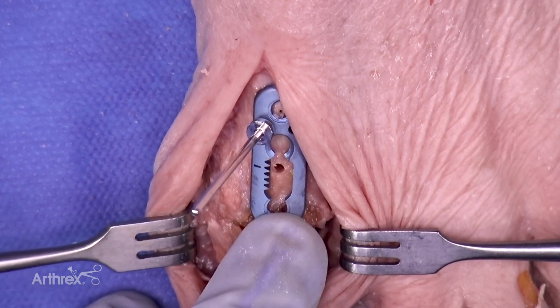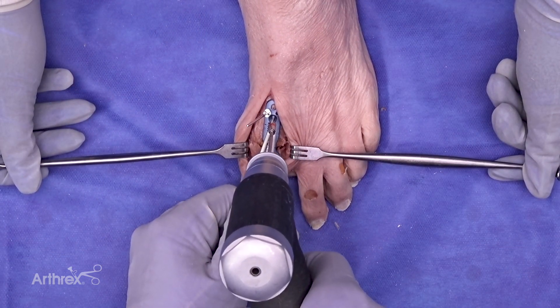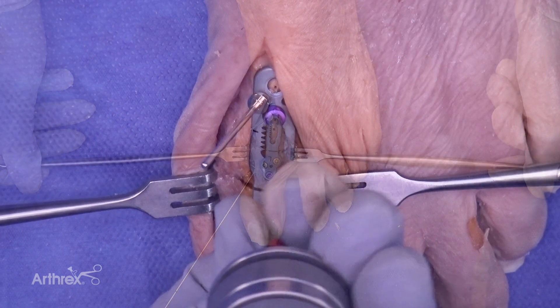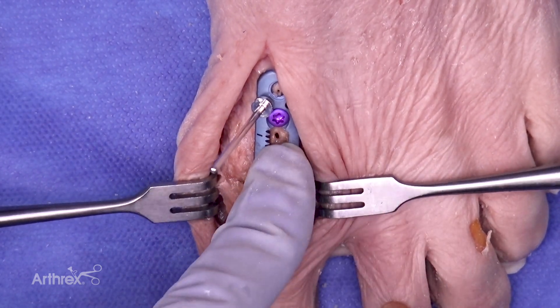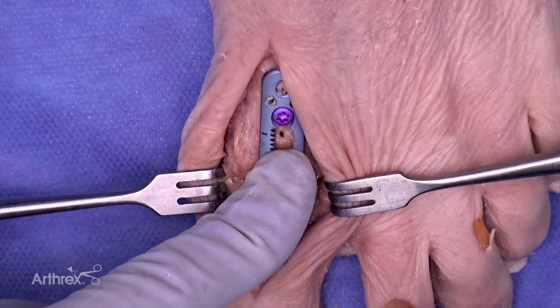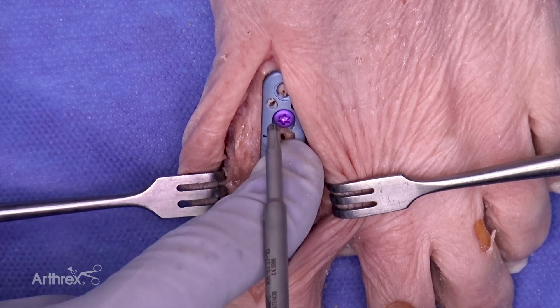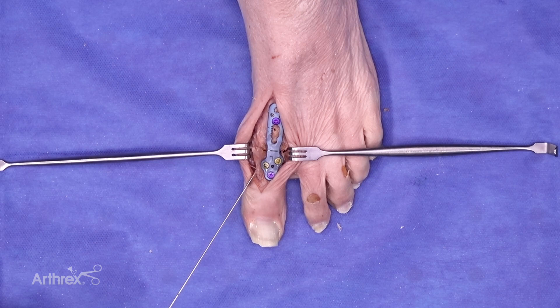At this point, we will remove the compression device and move forward with standard compression through the oblong screw hole. To maintain maximum compression, place the compression screw until it starts to engage the plate, then remove the BB-TAC, and tighten the screw down to allow maximum compression. With laboratory testing, on average 24 pounds of compression force was achieved through the compression geared technique, and an additional nine pounds of compression was achieved with the oblong compression hole in the plate.